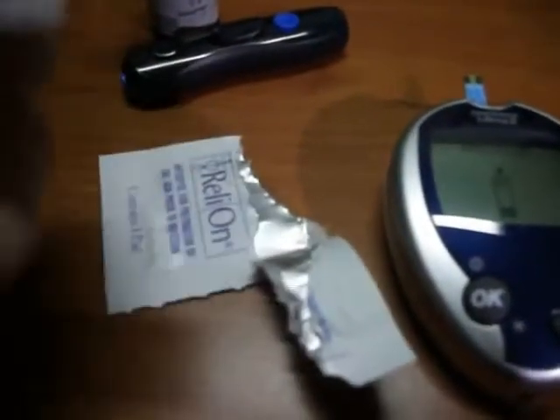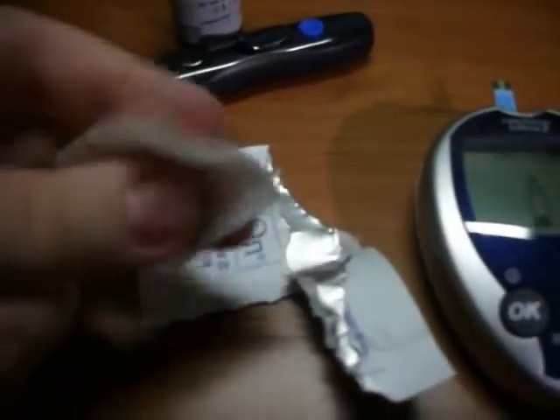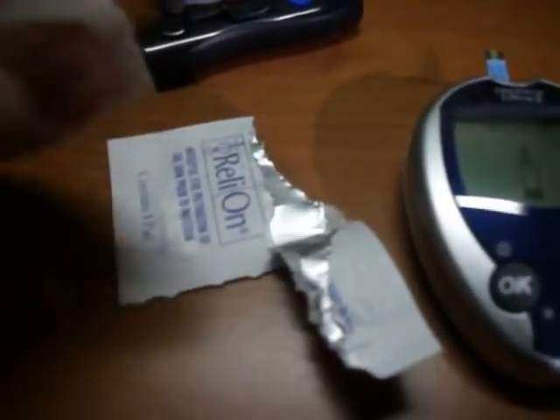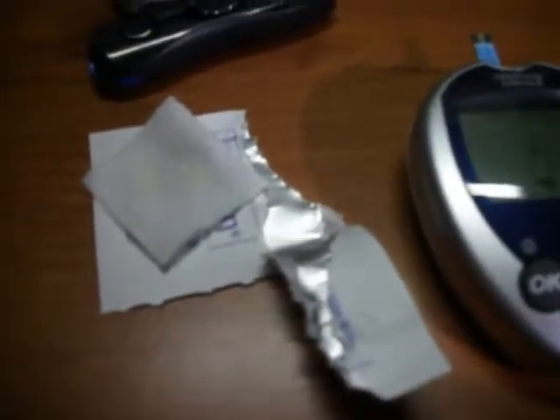Now I am going to take the alcohol pad. I am doing this one-handed so I am not doing this exactly carefully, cleaning a finger.